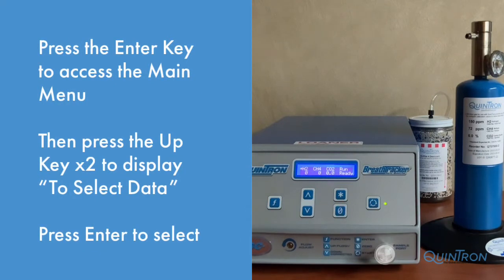In this brief tutorial, we are going to demonstrate how to calibrate your breath tracker analyzer. From the Run Ready or Cal Ready screen, press the Enter key to access the main menu.